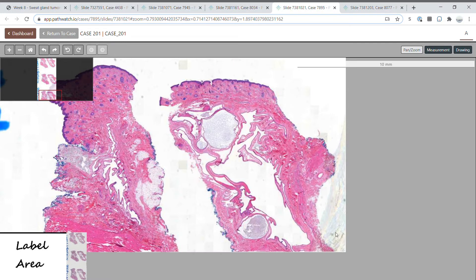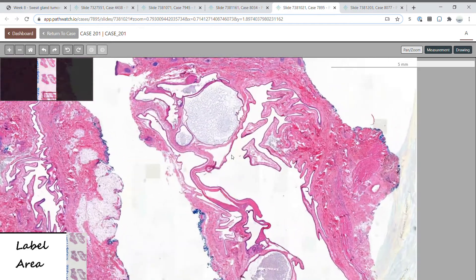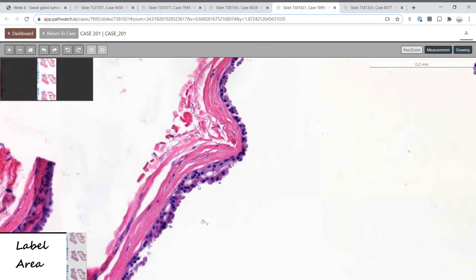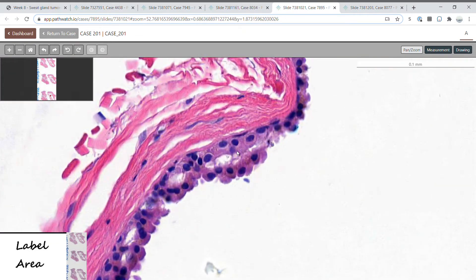Finally, this case shows a large multiloculated cyst in the dermis — this is an apocrine hidrocystoma. It is common in the head and neck, and in Moll's gland in the eyelid, and is associated with Schopf-Schulz-Passarge syndrome. Apocrine hidrocystomas are also lined by apocrine cells, with eosinophilic cytoplasm and apical snouts visible here.